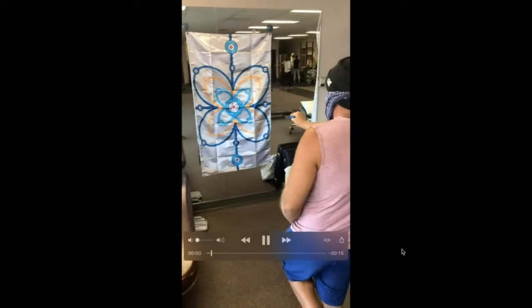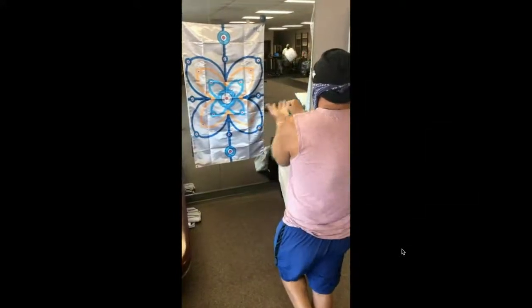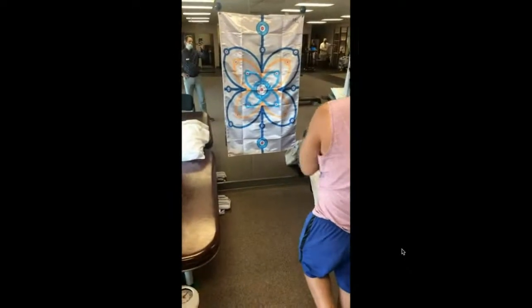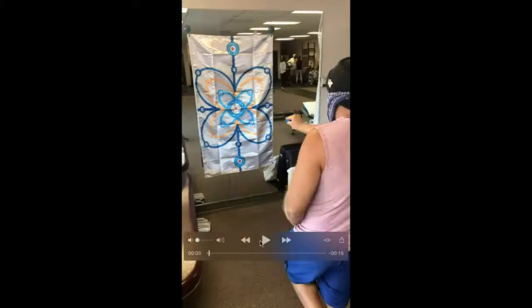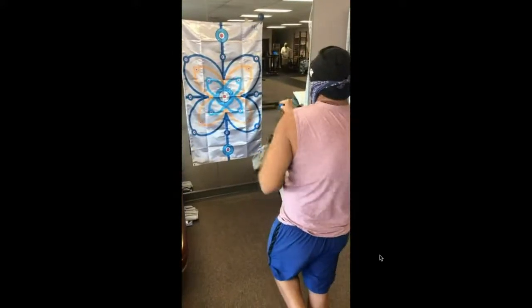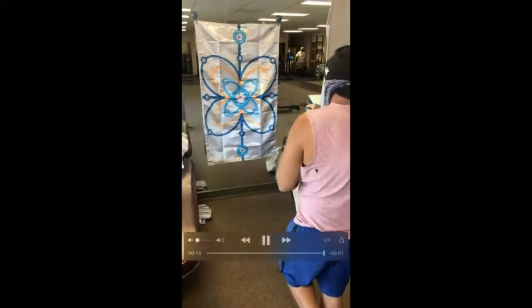So if we play the video out here, you can see the complex movement pattern with the right hand. Want that elbow extended if possible, and then he's going to have to do a prediction task with dual tasking with the toss and catch, and he's on one leg. There's me videotaping. Okay, so we can watch that one more time. Single leg stance, complex movement patterns, maybe some peripheral vision, some dorsal stream vision going on there, dual tasking with a toss and catch there. So this person is post CVA, mild effect.